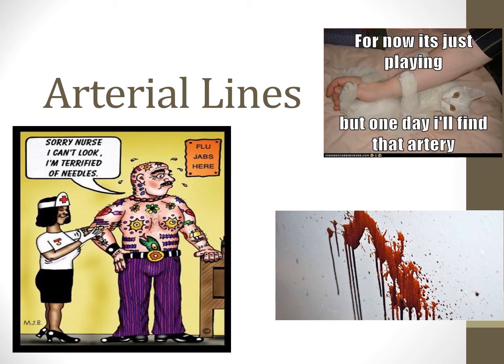Now, I have this picture here on your bottom right-hand corner of the blood splatter on the wall. There's a quick story behind that one. When I was a new grad on night shift, I was drawing off of an A line and trying to expel the air bubble, and sure enough, the cap came off and squirted it on the wall there. I felt really embarrassed about that whole situation. So be careful when you're trying to expel those air bubbles, otherwise you might end up with something like that and a lot of embarrassment. So just have fun. But not too much fun.